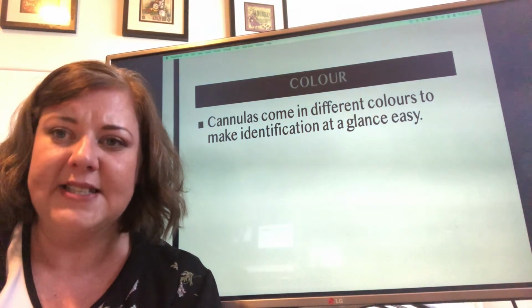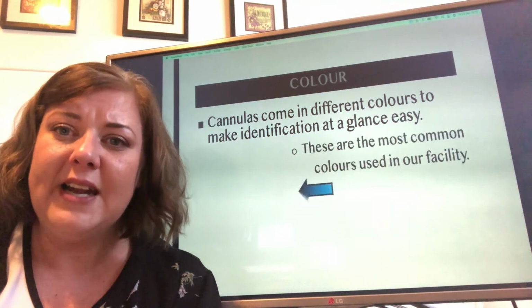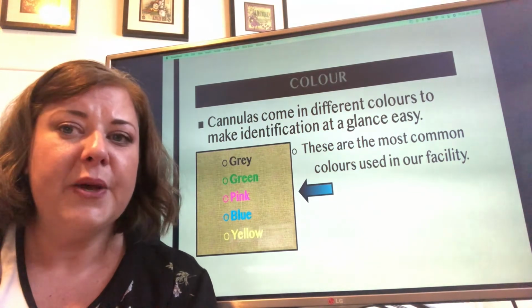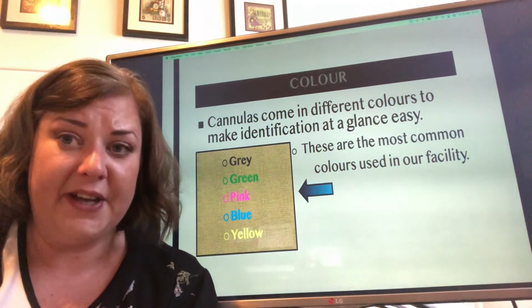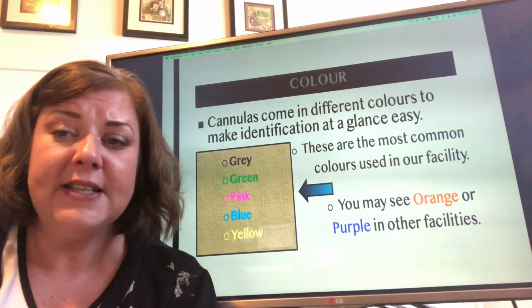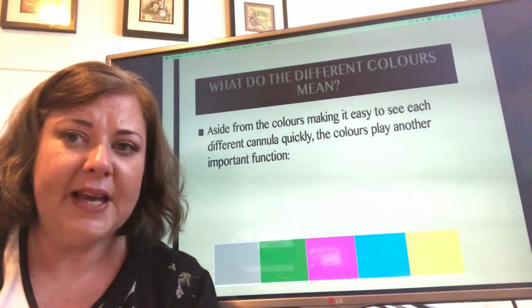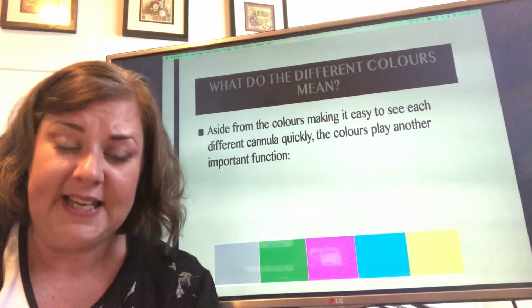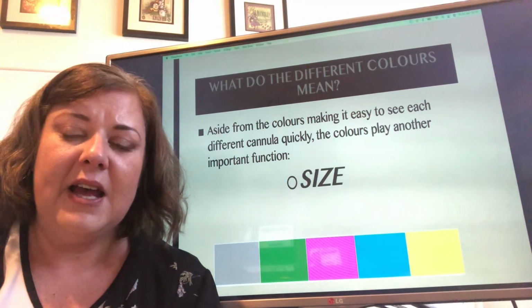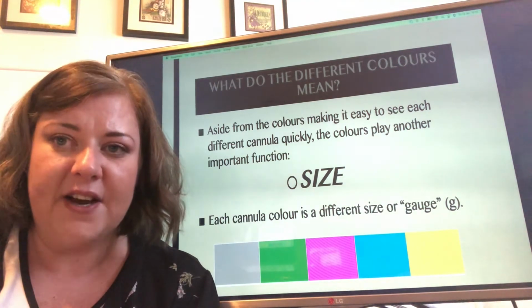Cannulas come in different colours to make it easy to find the one you're after at a quick glance. In our facility, you're going to come across grey cannulas, green, pink, blue and yellow cannulas. Other facilities may have orange or purple cannulas, but we do not use them here. Aside from making picking out a cannula easy, colours have another really important function, and it's size. Each cannula colour is a different size or gauge.